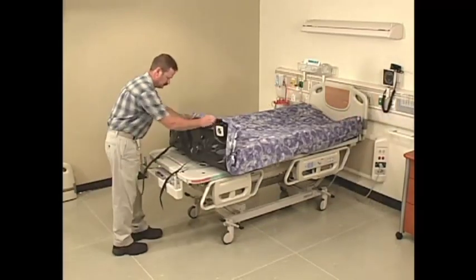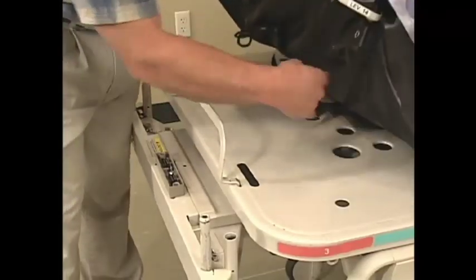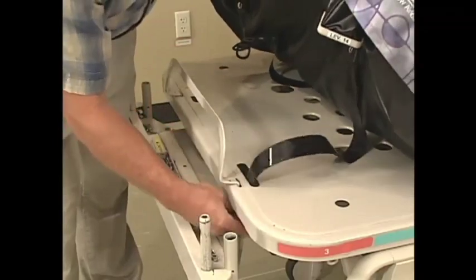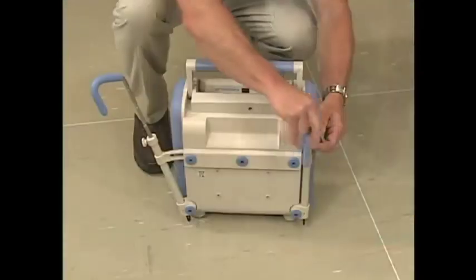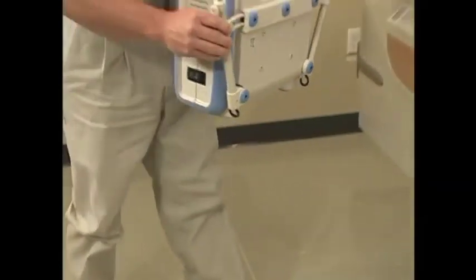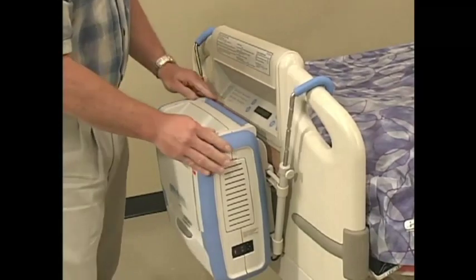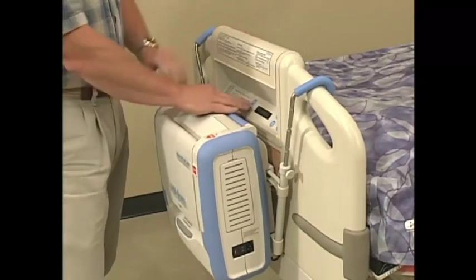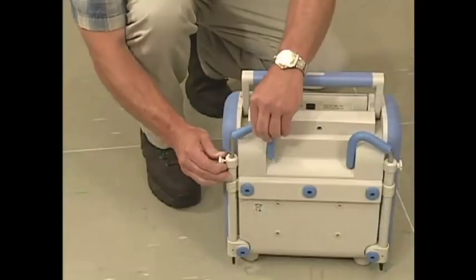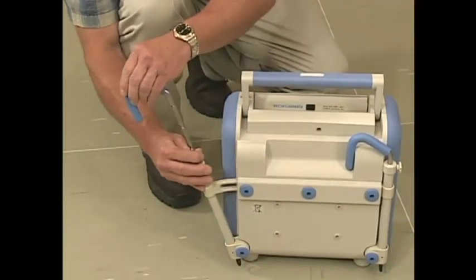At the foot end on the Advanta deck, the technician raises the mattress stop, then secures the foot end therapy surface straps. To install the air supply unit, or ASU, the technician first adjusts the hanger brackets to ensure the ASU will not interfere with the bed controls on the footboard. The brackets adjust sideways, as well as lengthen, to fit a specific footboard.